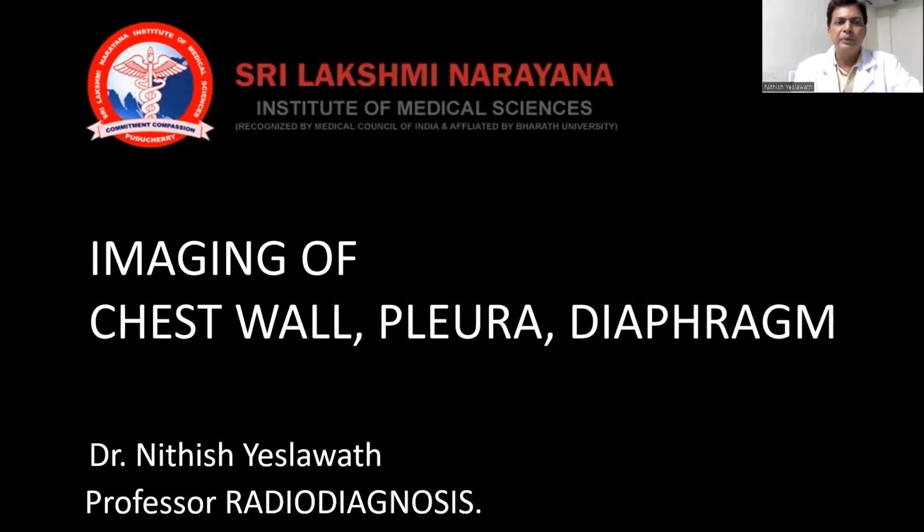Today we are discussing imaging of chest wall and pleura and diaphragm. I'm Dr. Nithish here. I'm Professor of Radiology. We'll have some images of radiograph, CT scan, ultrasound images, MR images. So we'll go through them. We'll have a discussion about that.